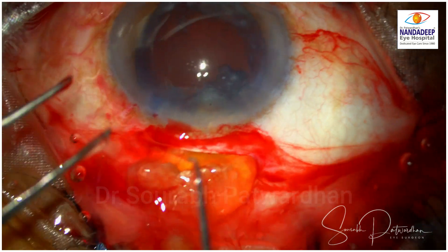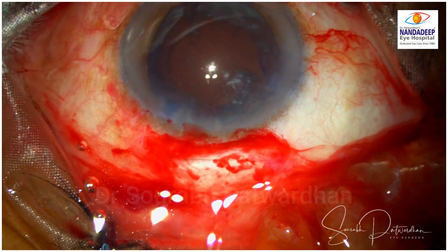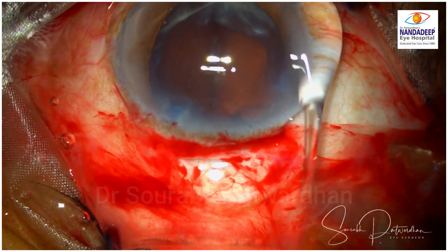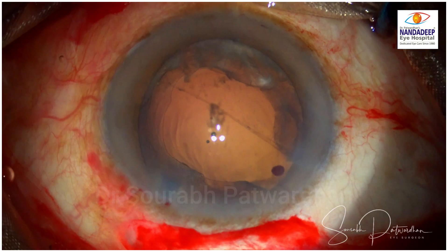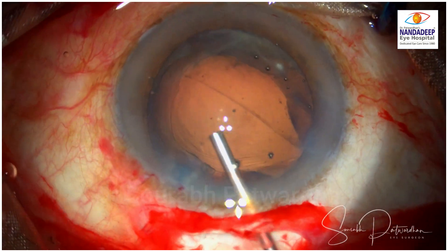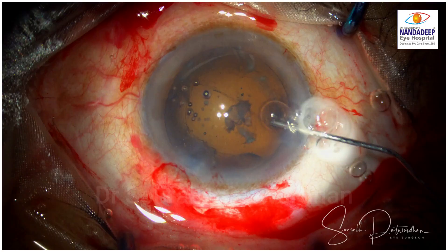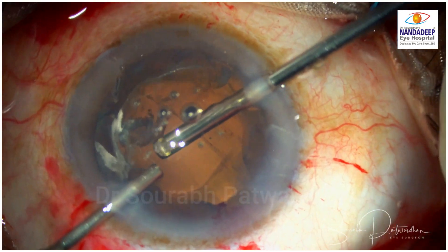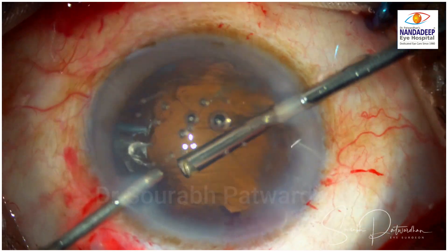Just lifting the anterior tunnel and then pressing the posterior lip — that's the way to go. You can see there is a radial tear right from the area where there is an anterior capsular tear. It has gone back on the posterior capsule and half of the PC is absent. So now I am going to start anterior vitrectomy, though there is very little vitreous because the anterior hyaloid is mostly intact.